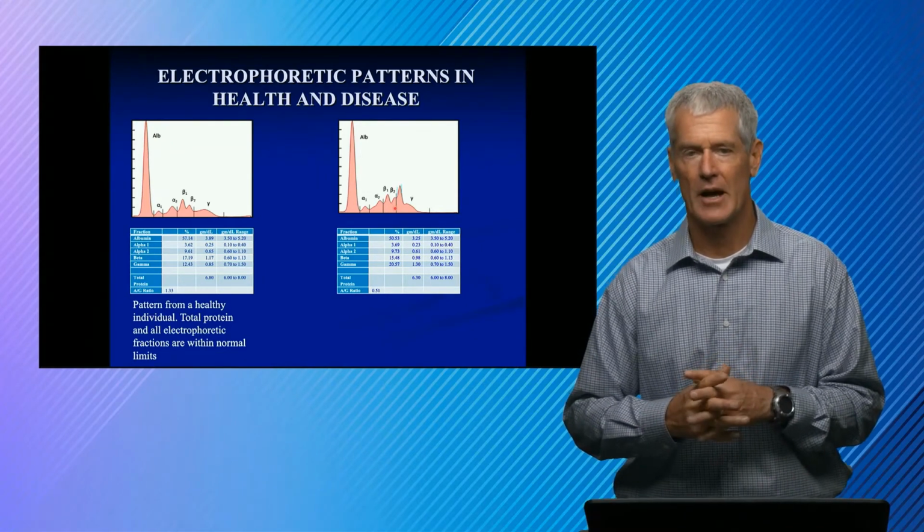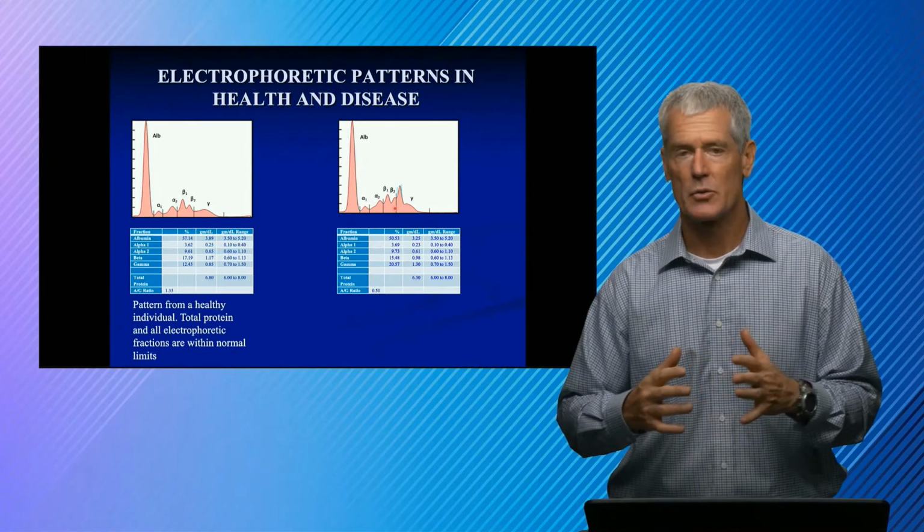And in fact, as it turns out, this was a serum sample. I mean, this was a plasma sample.